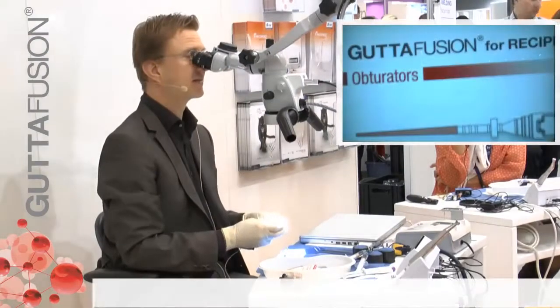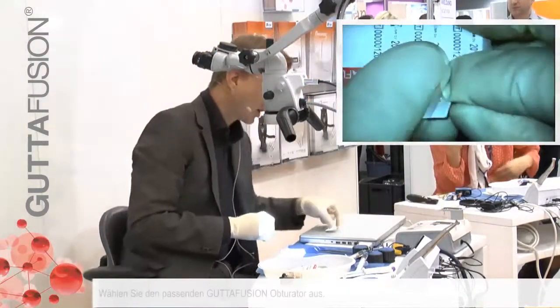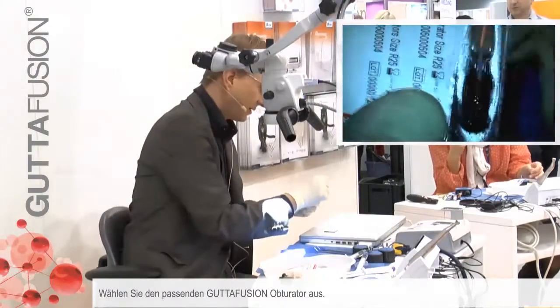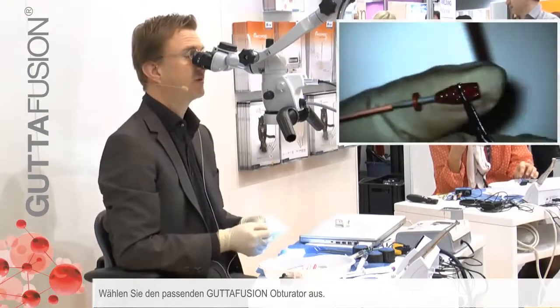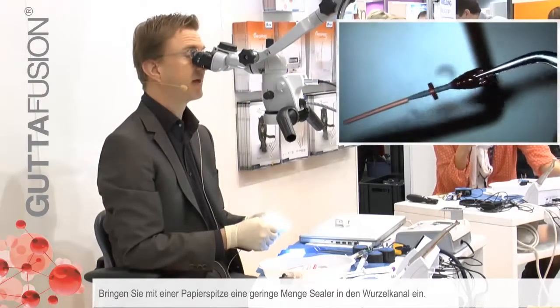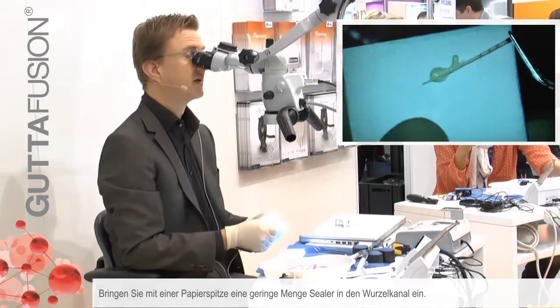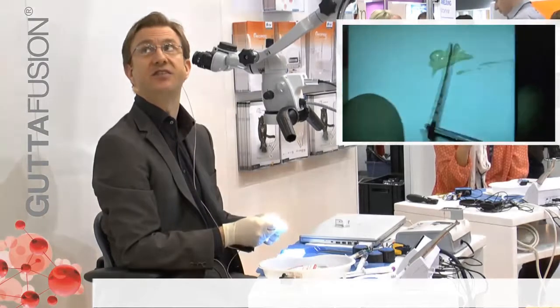I will demonstrate it on one of these plastic blocks. I have chosen the appropriate Guta Fusion obturator and I take a paper point to insert the sealer. This is the amount of sealer that I actually need.